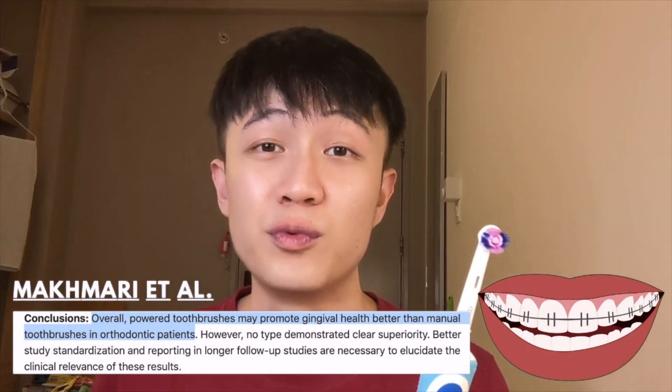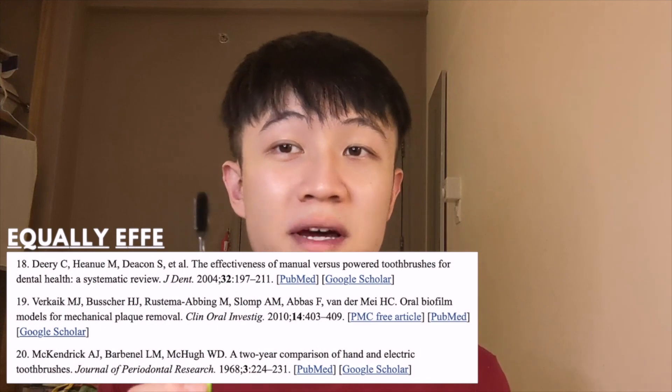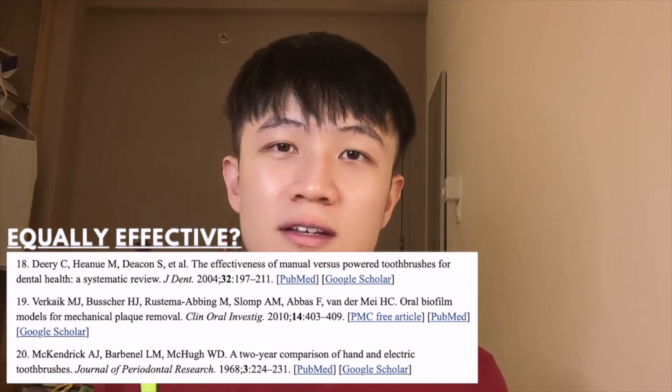Some studies suggest that an electric toothbrush is better at removing plaque and also improving your gum health. Other studies have also indicated that an electric toothbrush is better at removing plaque for individuals with braces or orthodontic treatment. On the other hand, other studies have suggested that the manual toothbrush is actually equally effective. So let's put it to the test today.